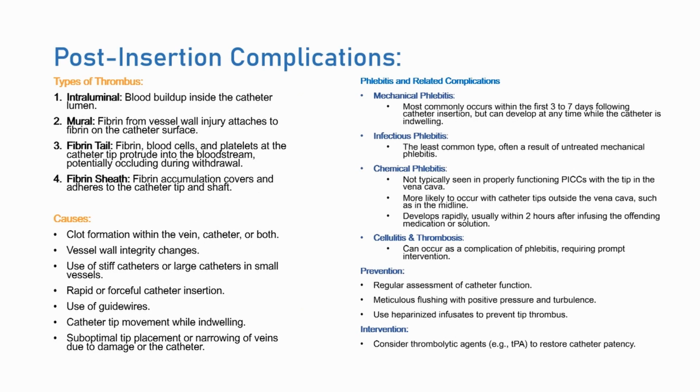Post-insertion complications, phlebitis and related complications. Mechanical phlebitis most commonly occurs within the first 3 to 7 days following catheter insertion, but can develop at any time while the catheter is indwelling.